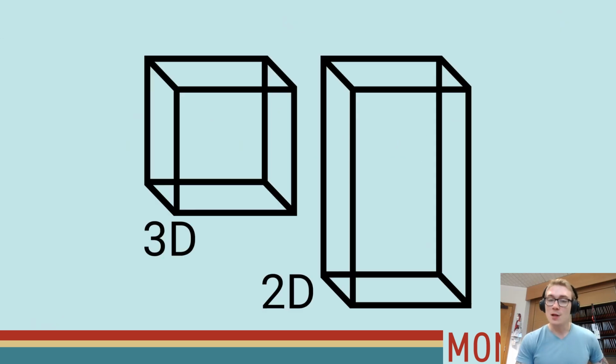Most people watching this will be familiar with MRI terminology, but as I will be referring to 3D and 2D MRI throughout the talk, I'll just clarify what I mean by this. When I say 2D, I'm referring to images that are still 3D, that is, still stacks of 2D slices. But whilst 3D MRI scans are made up of voxels that are isotropic, i.e. 1 millimeter by 1 millimeter by 1 millimeter, a researcher or clinician may choose a 2D sequence to cut down on scan times by reducing the number of slices, thus elongating the voxels in one direction to something like 0.4 millimeters by 0.4 millimeters by 3 millimeters. The in-slice resolution is still high, but when looked at sideways, the resolution drops.